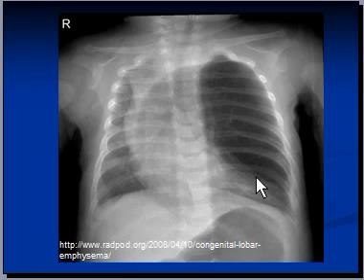There is no pneumothorax, because you can still see the vascular markings through the left lung. In the case of pneumothorax, you would see a collapsed lung with the visceral pleura clearly visible. In this case, the left lung seems hyperinflated. This X-ray is a very classical picture of a condition in newborn babies known as congenital lobar emphysema.